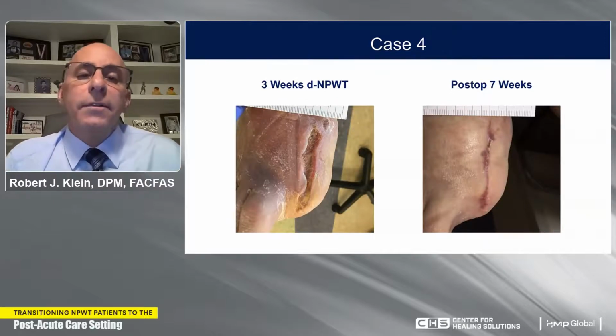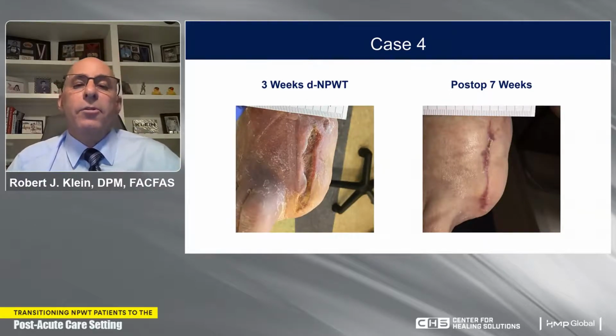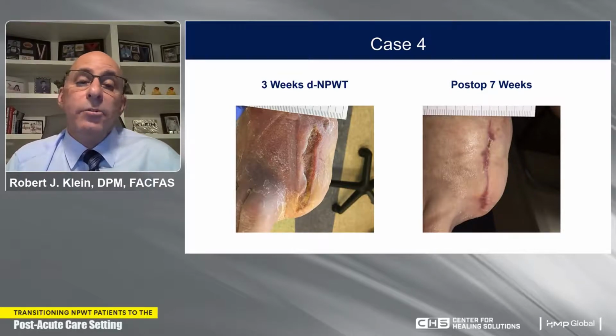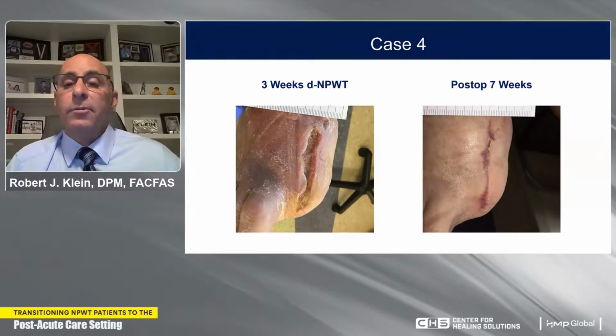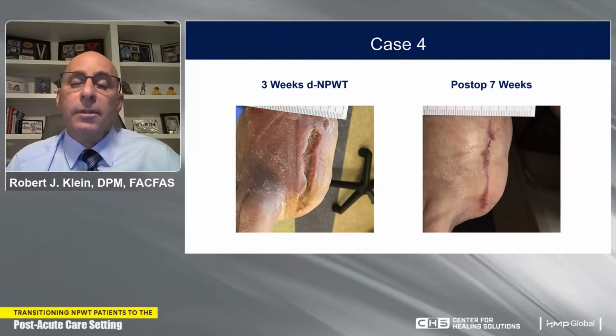The photo on the left is the patient 3 weeks after using disposable negative pressure wound therapy. You can see that the granulation tissue has come up almost to the skin line. Edema is dramatically reduced. There's minimal, if any, exudate coming from the wound. And this was a wound that, once again, I used an advanced wound care dressing, collagen, silver, and ORC to take onto closure. The patient was seen at 7 weeks post-op. His wound is completely closed. He was fitted for a diabetic shoe and custom insole, and he has done well after that procedure.